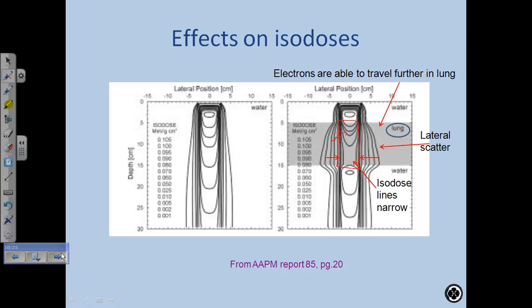Okay, but some of the photons that go straight through are depositing more energy downstream. So the dose being absorbed down here is going to be higher. Okay. So that's what happens. You lose energy to the sides, and what you're trying to treat, if it's inside the lung, is getting less dose.